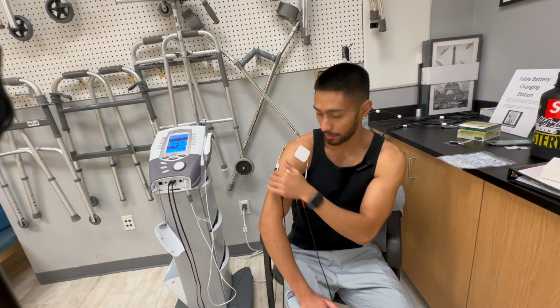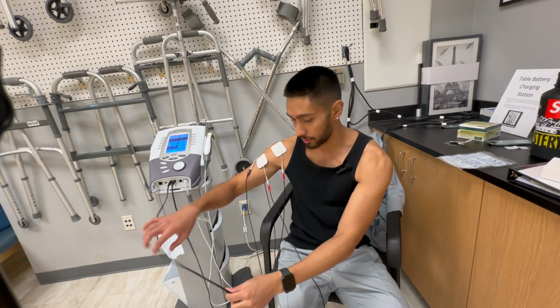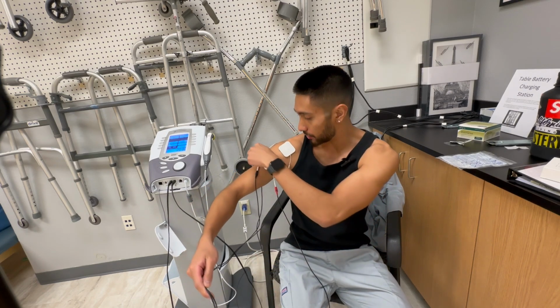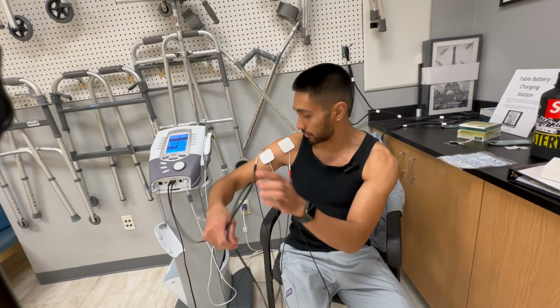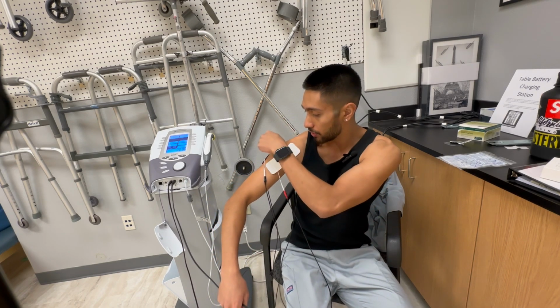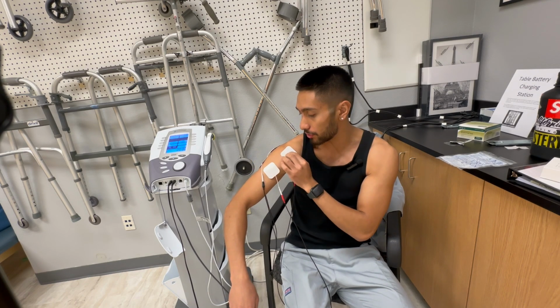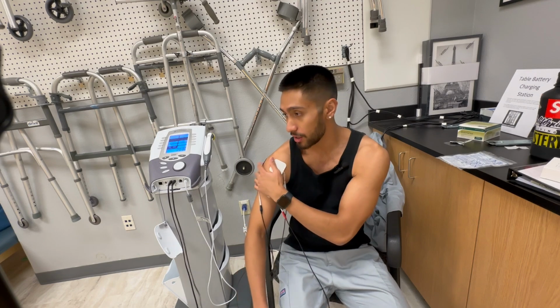But all the pads are there. And once again, these channels cross. This wire is channel 1 and it's going here and here. This wire is channel 2 and it's going here and here. So it goes a line, makes this X pattern. That cross section area is where the treatment area is going to be. Once again, we're targeting the middle deltoid for the pain reduction site.